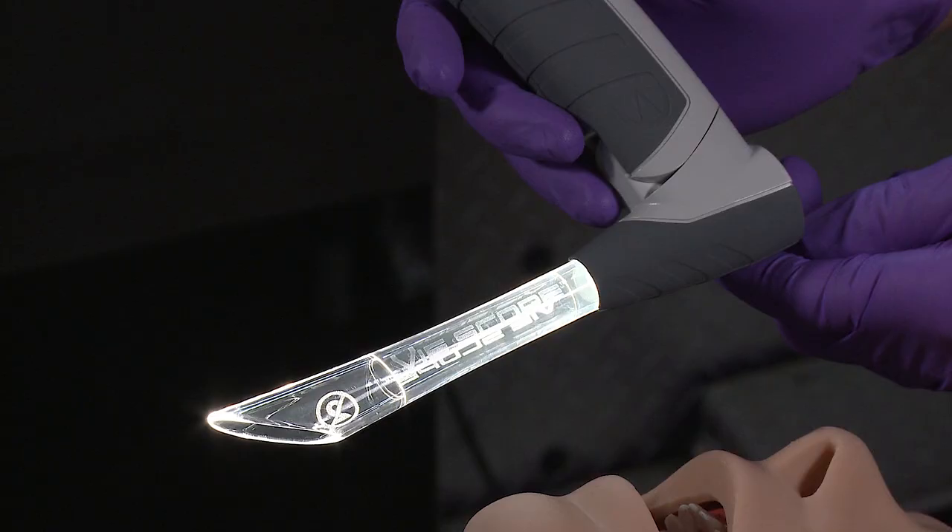Because the V-scope is not a traditional laryngoscope blade, there are a couple of things to remember about it that, once you learn, make it incredibly easy to use. In fact, the V-scope is so easy to use that in one of my first training sessions with some paramedics, some EMTs happened to be in the room too and wanted to try it. After just a couple minutes of training, every EMT was able to successfully place the bougie through the V-scope into the airway and introduce an endotracheal tube into the airway in a training mannequin on the first try.